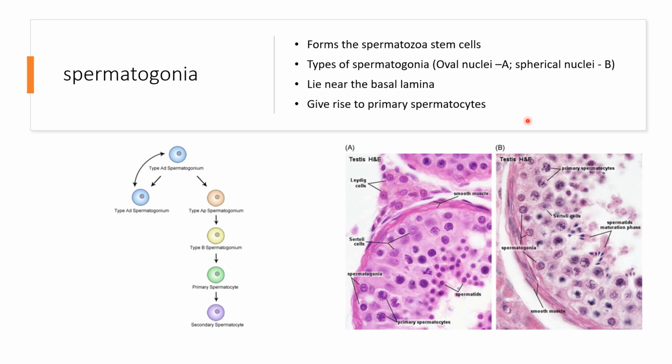to use to differentiate between the type A and the type B cells of this is that the type A will have an oval nuclei. So the nuclei is usually oval in shape, while the nuclei of the type B is spherical in shape. This is a character you may not be able to make out in a typical class slide, okay, but under electron microscopy, you should be able to appreciate this and then see the variations within the nuclei.